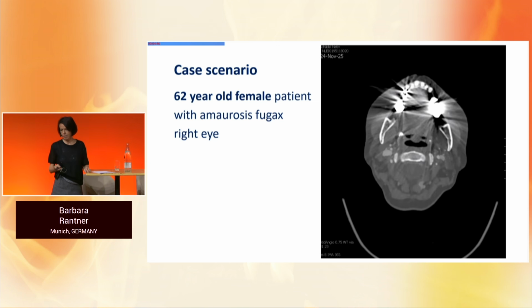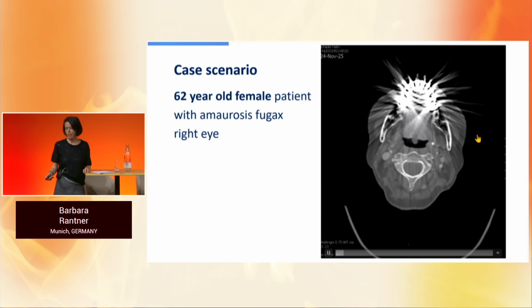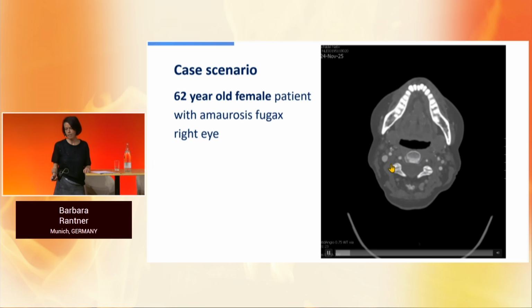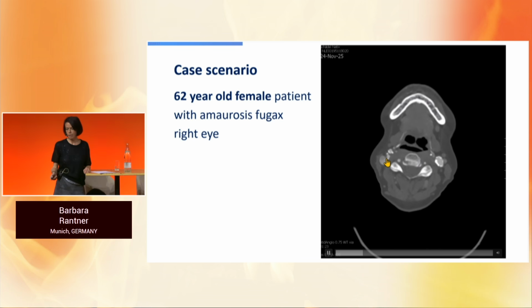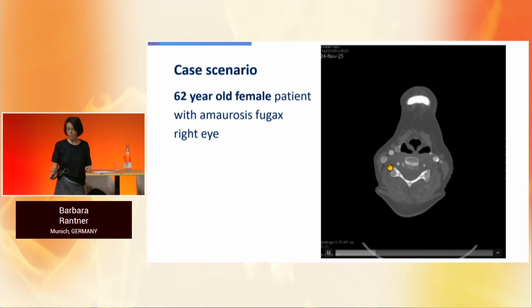I want to draw your attention to the variability of lesions in the carotid circulation on the right side. We try to focus on the internal, pretty well coming from above. Then we enter the bifurcation, and we have this deficit. Then the common carotid, which is the area we pictured in the ultrasound.